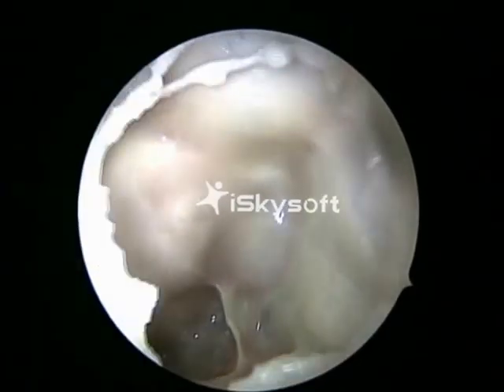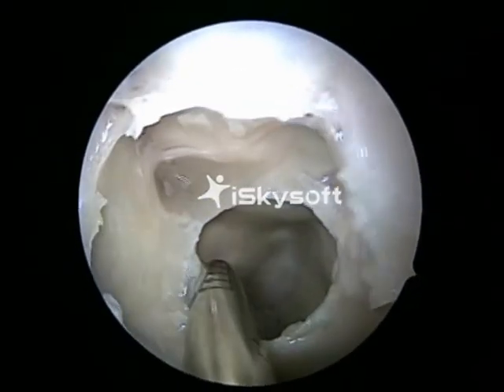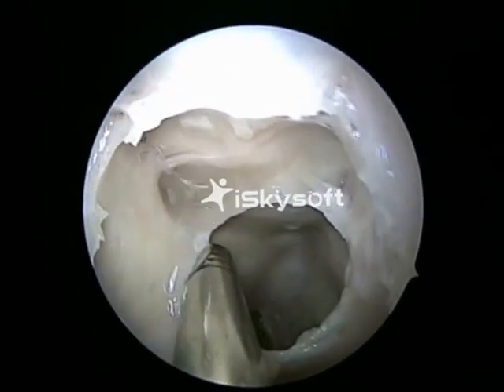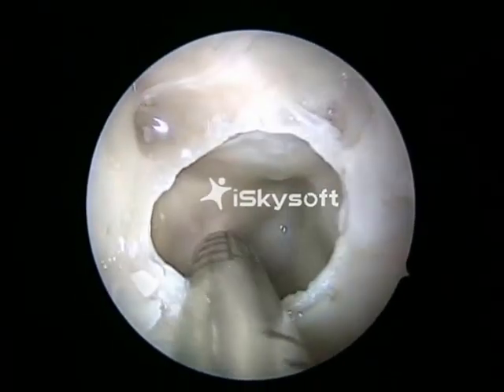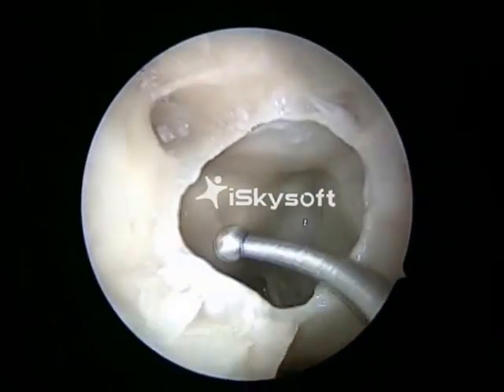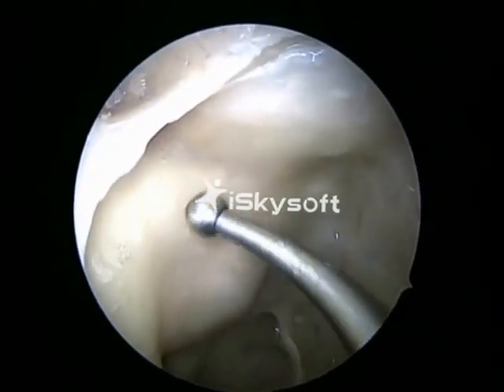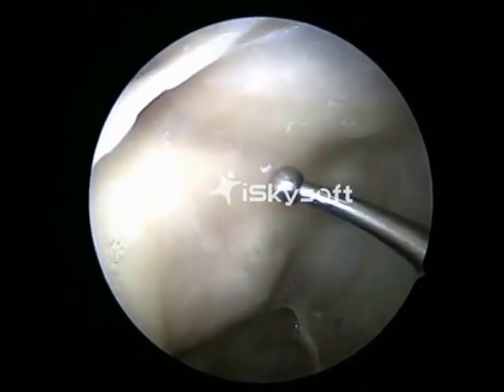We use this punch to take away the bone till the skull base, and then a debrider is used on its lateral aspect till the orbital apex, till the lamina papyracea. Now the sphenoid sinus is opened very wide. You can see the optic nerve, the orbital apex.